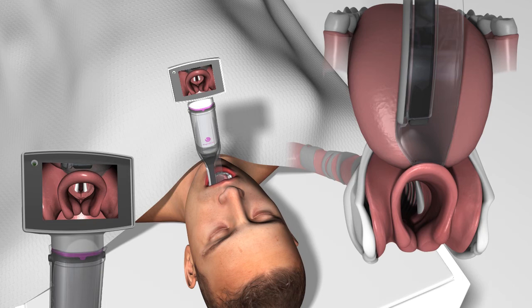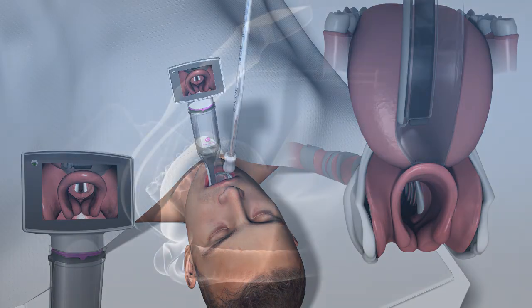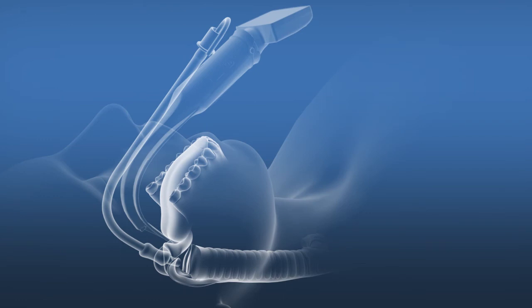Once you can see the vocal cords on the display, insert the tube with the preloaded stylet into the mouth until the tip reaches the posterior pharynx. Then manipulate the tube to direct its tip toward the vocal cords. Advance the tip just through the cords and then retract the stylet prior to advancing the entire tube into position in the trachea with the cuff below the cords.